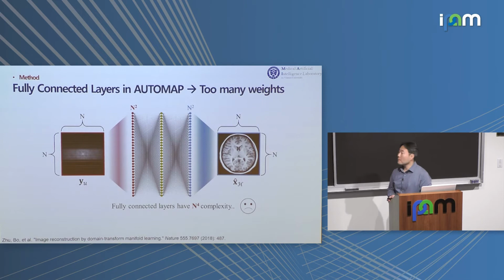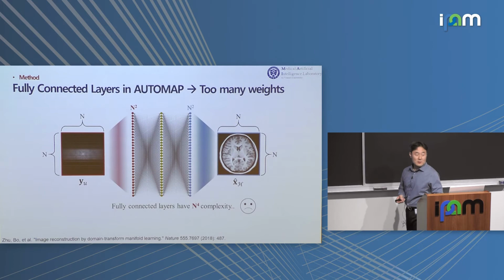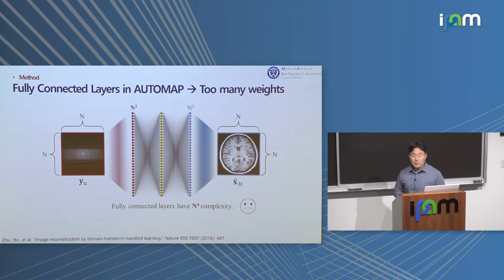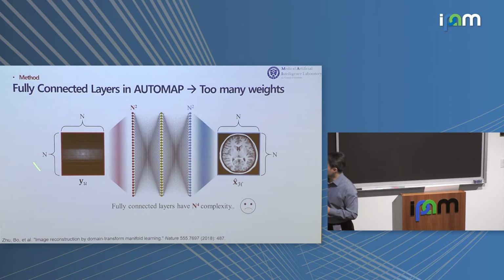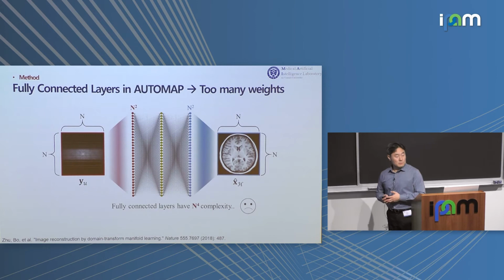So it is not applicable to our case, at least. For example, for the standard resolution of 256 by 256, this approach cannot be applied. However, if we examine this sampling strategy, which is called the Cartesian sampling scheme, we can look at this problem a little bit differently.